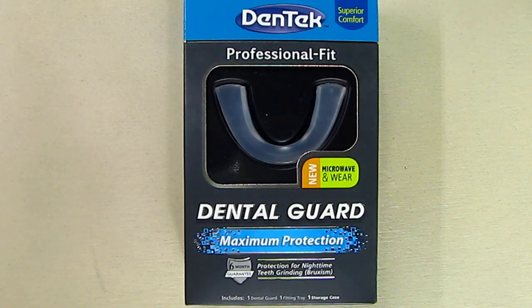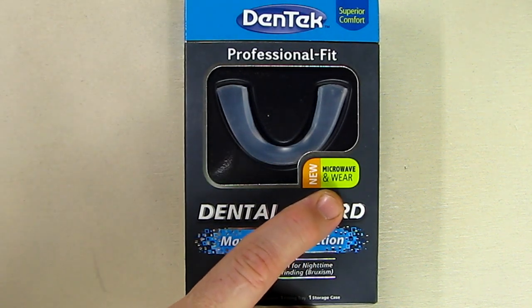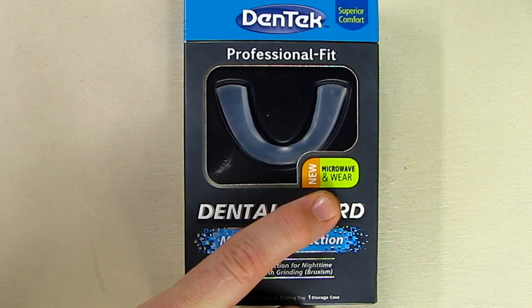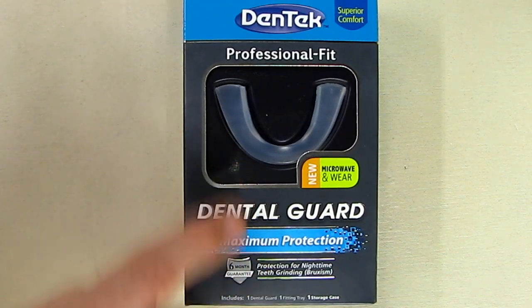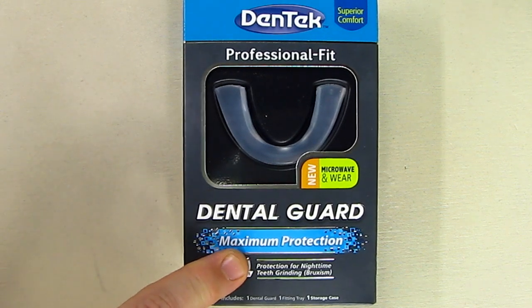Hello again, this is Robert Veach here and this is my video review of the Dentec brand Professional Fit Dental Guard. This is a new version — microwave and wear. I've used previous versions where you boil it, and we're going to see if that's still an option. I've used another version of this that has lasted me several years, so it's time to replace it.